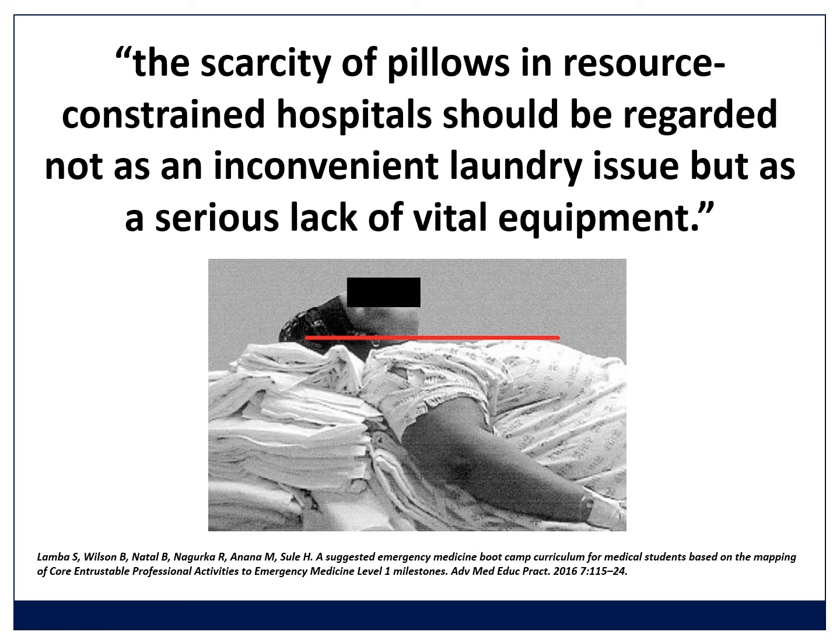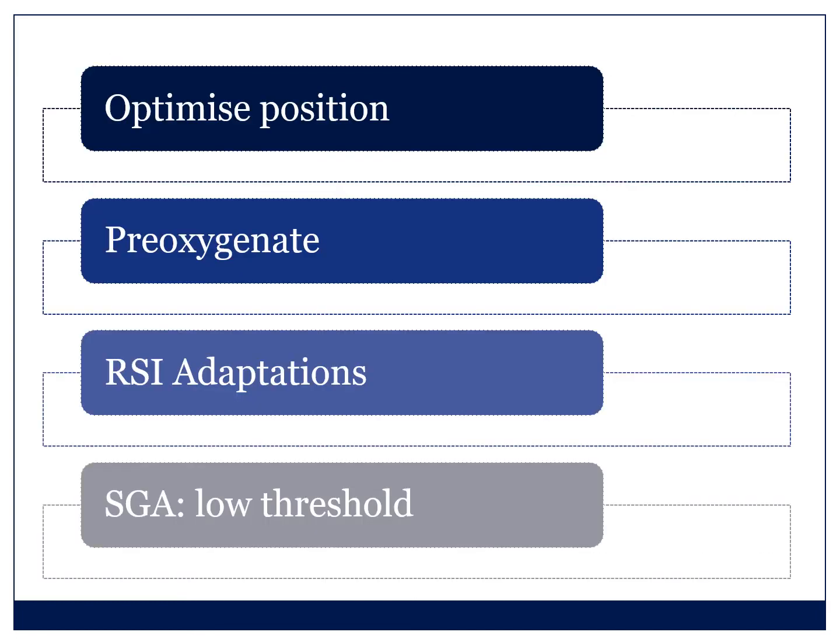Look how beautifully this airway has been prepared. That ear is in line with the sternum. You can see the thyromental distance has been maximized. That's a nice long thyromental distance, and this intubation I think is going to go fine. But if you put this patient on her back supine, it's going to be a disaster. It's going to be very difficult to see. So get your patient up at 25 degrees and then further ramp the head. The next element of these four components is preoxygenation.